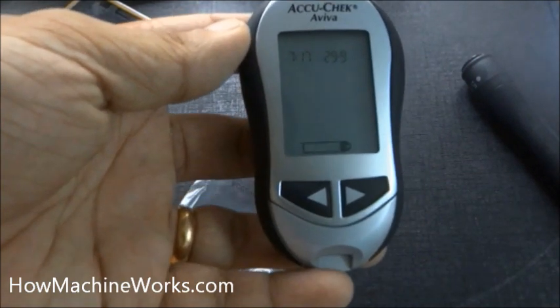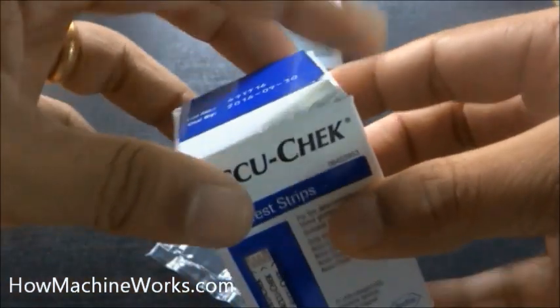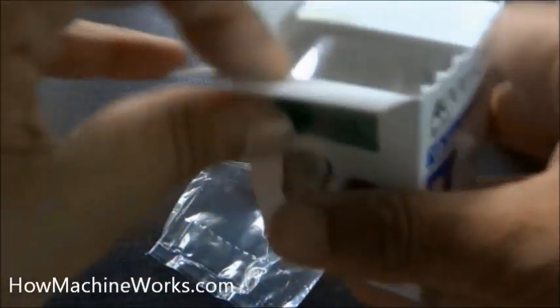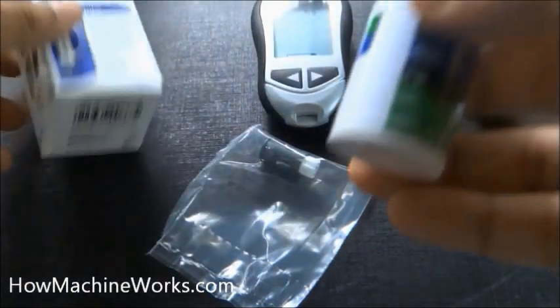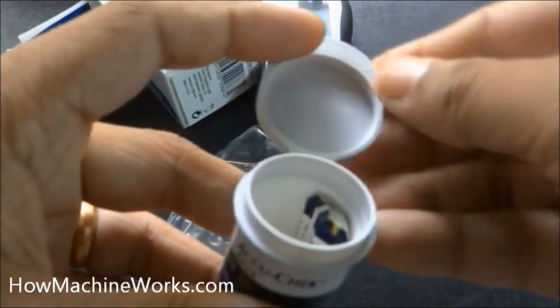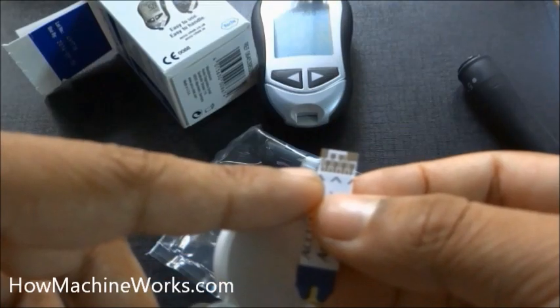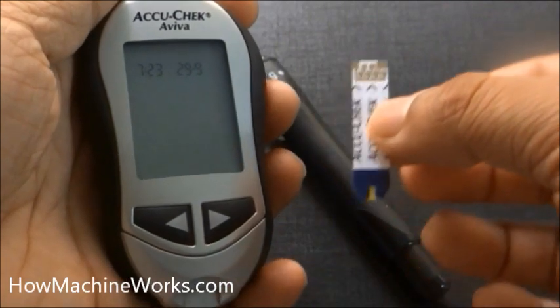We need to get one test strip from the pouch and install it to the meter. In this box we have ten test strips. Before using it, check the manufacturing date to make sure it can be used. Take one strip out. You can see the top — that's to be installed to the meter — and the bottom yellow portion is to be dipped into the blood.